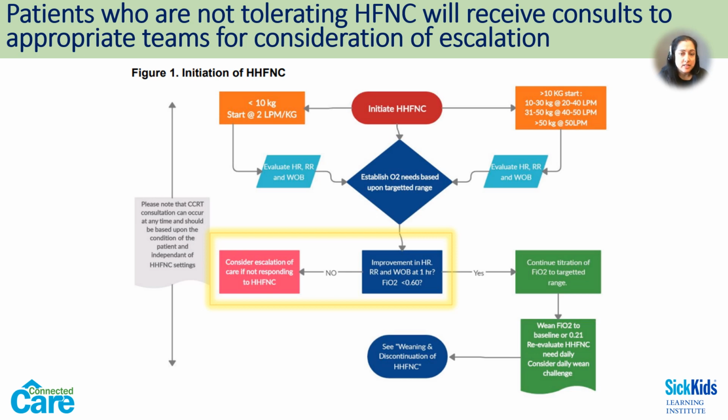If anyone is presenting with severe work of breathing, we can initiate high flow nasal cannula for them, and we could involve rapid response or whatever medical leads you have at your sites in the guidance on how to manage these patients, and when it's appropriate to be reaching out through critical care or whatnot to other resources you have in the community. If they tolerate the initiation and you have improvement in these vitals, then we would say they're a good responder to it, and we would keep them on heated high flow nasal cannula and titrate their FiO2 to the target range.